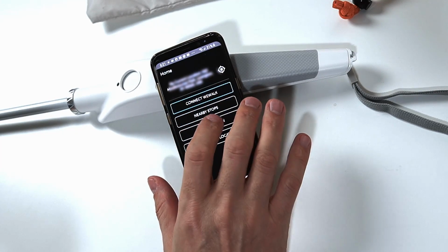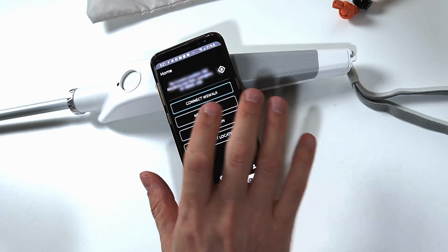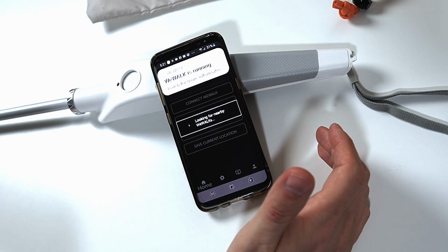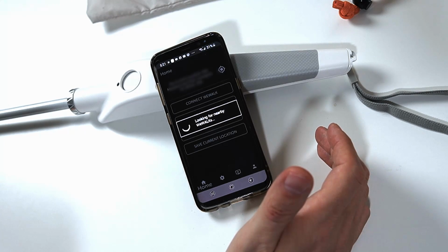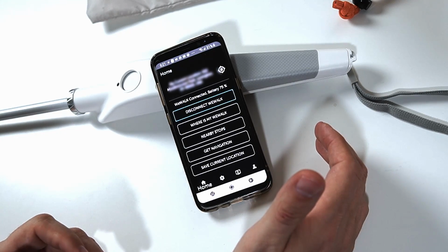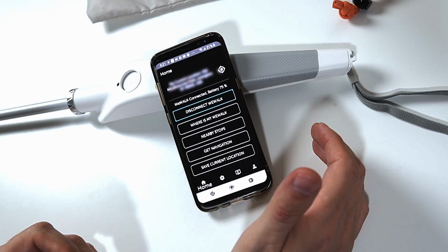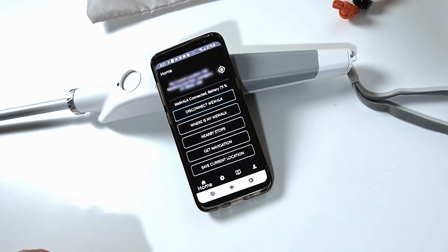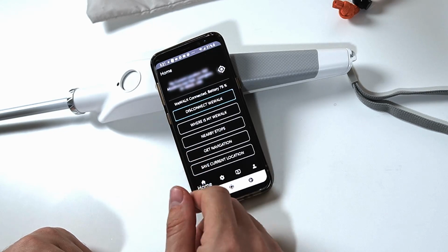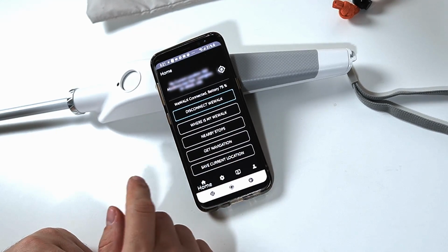Connect WeWalk button. Alert: looking for nearby WeWalks. And it is connected. Very fast. Once you connect it the first time, it's very fast to connect. It gave us a little audio tone letting us know that it was connected. And now that connect has changed to disconnect.